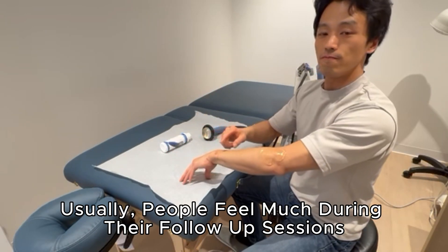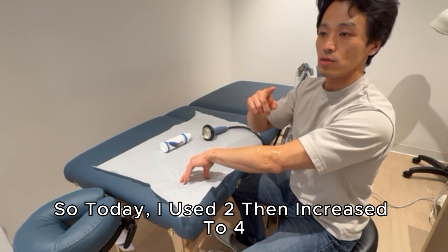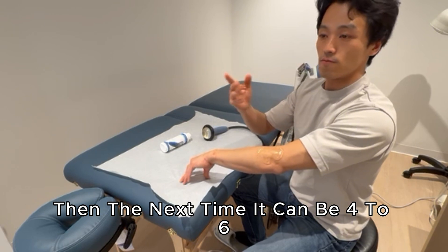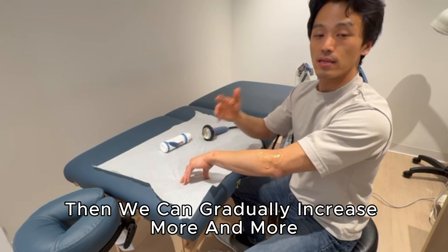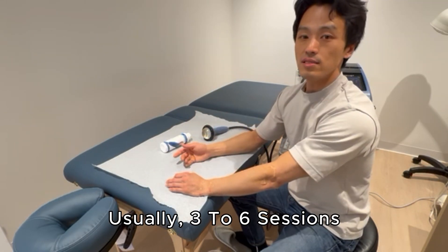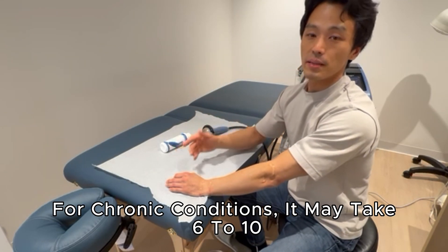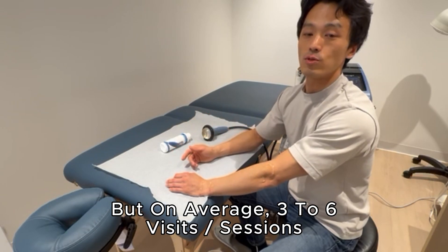In the next session, people usually feel much better and less sensitive, so I increase the intensity. Today I used intensity 2 to 4; next time it will be 4 to 6. As the tissue condition improves we can keep increasing. Usually it takes 3 to 6 sessions, but it varies — chronic conditions may take 6 to 10. The average is 3 to 6 visits.